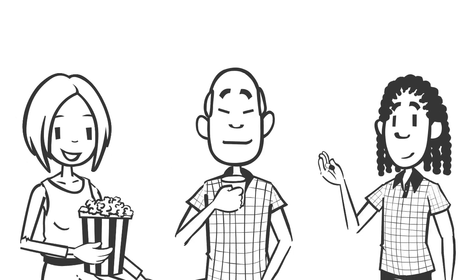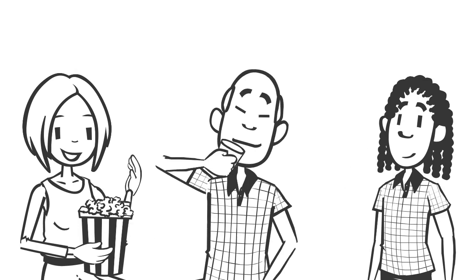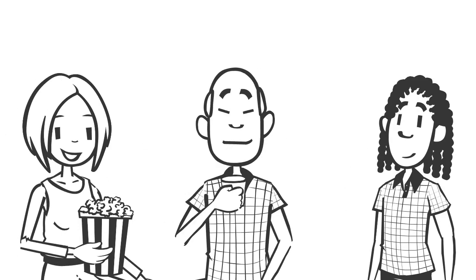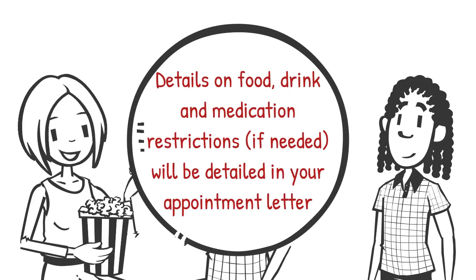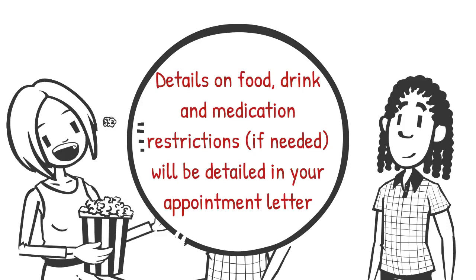In most cases, you will not have to stop eating, drinking, or taking any of your medication before your scan, but you should always check the information your hospital sends to you to ensure that this is the case for your scan. If this is not the case, instructions on how many hours to restrict food and drink for and what medication you need to stop taking will be detailed in this information from the hospital.